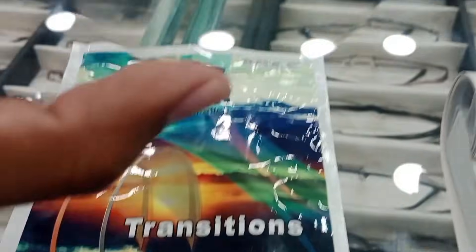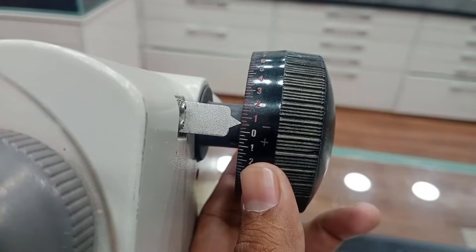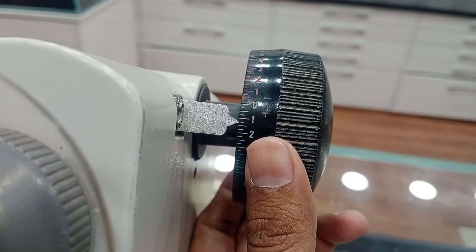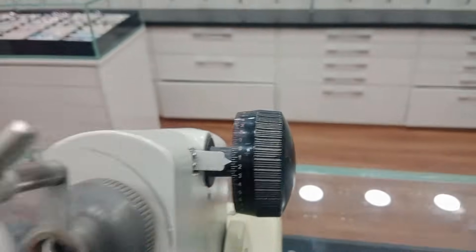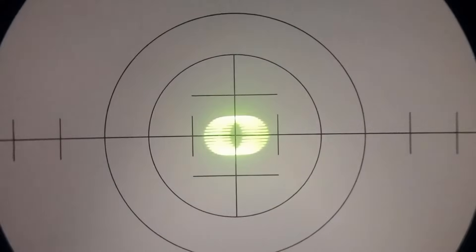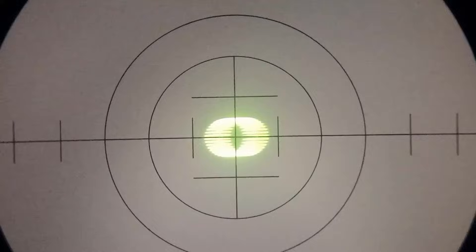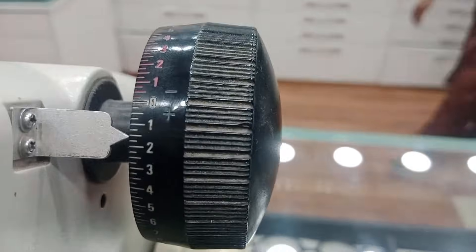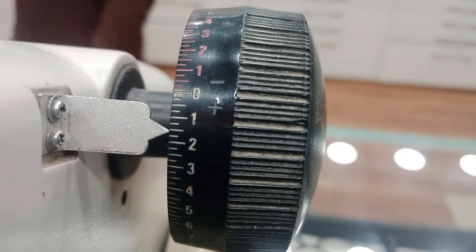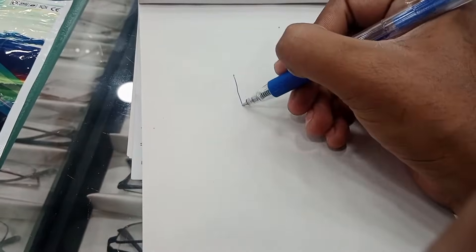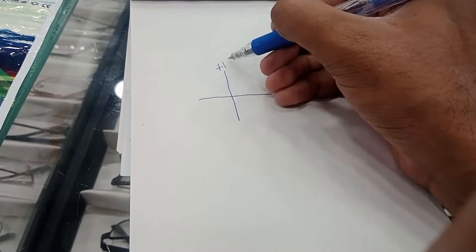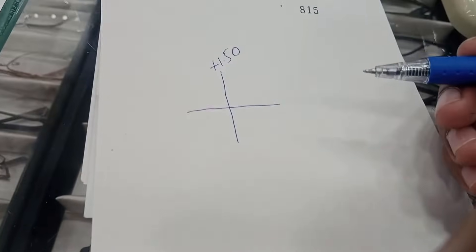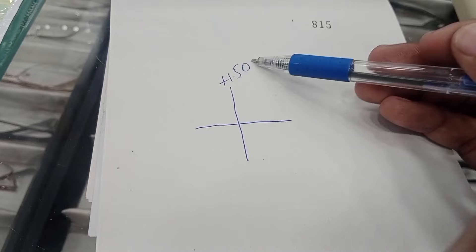Now the third lens. We will clear our first meridian and it's getting clear at almost plus 1.5. So we will make an optical cross and the first meridian is plus 1.5.